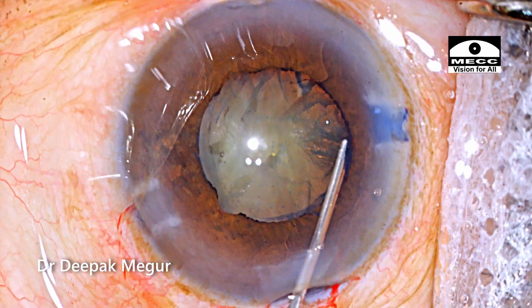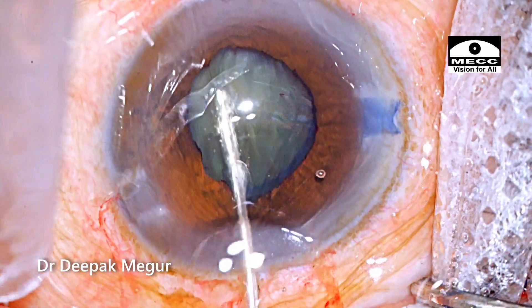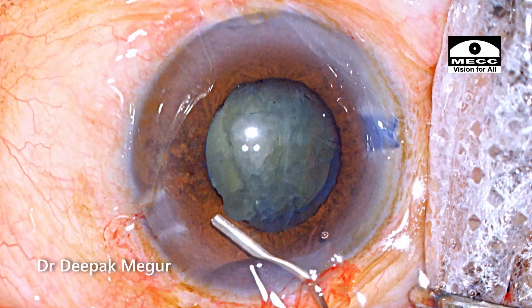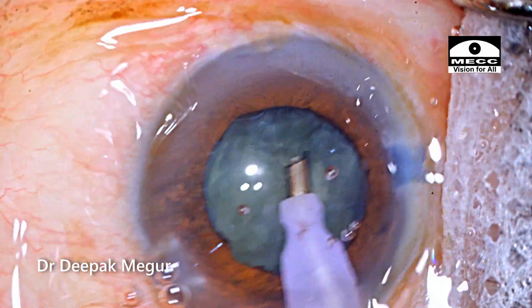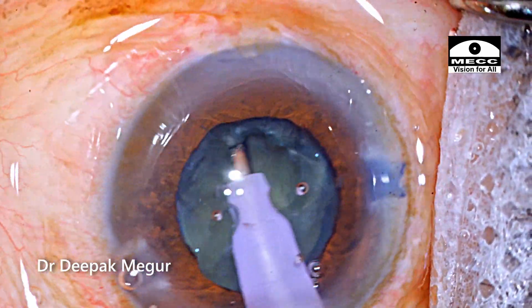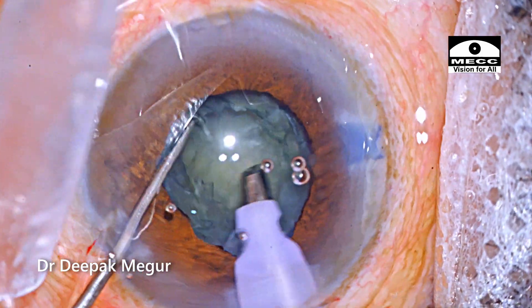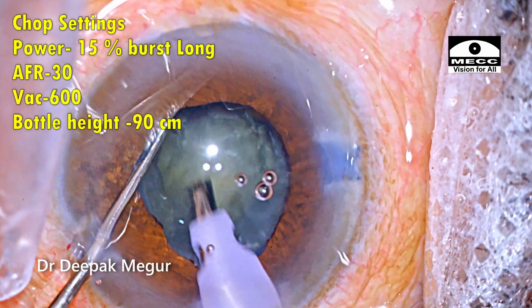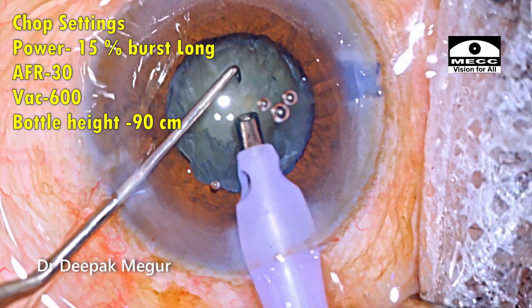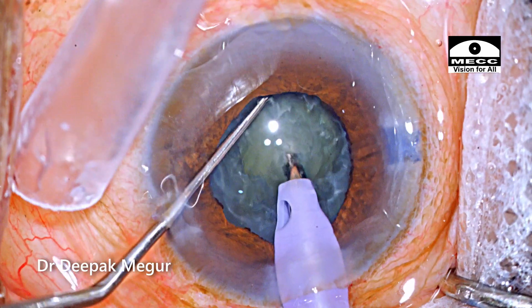Performing hydrodissection and ensuring that the lens matter is totally free from the capsule. Time to emulsify the nucleus. The superficial cortex is aspirated. I'm going to perform a direct vertical chop. The first setting I'm going to change is the power setting — I'm going to reduce the phaco power. I'm going to use just 15% power in longitudinal mode to bury my phaco tip into the substance of the nucleus and then create a chop.